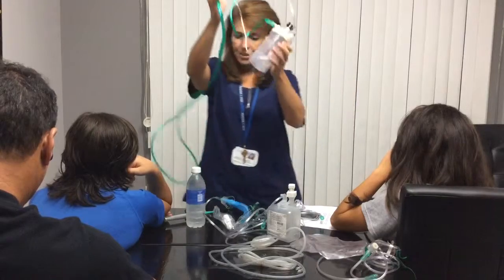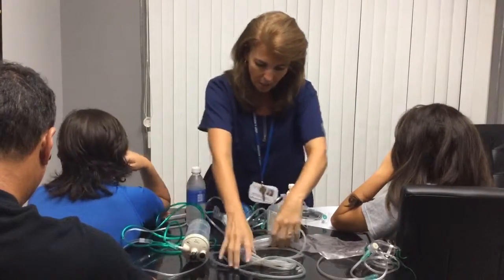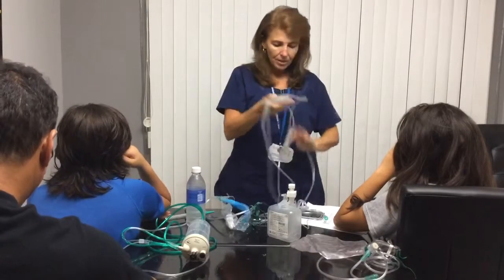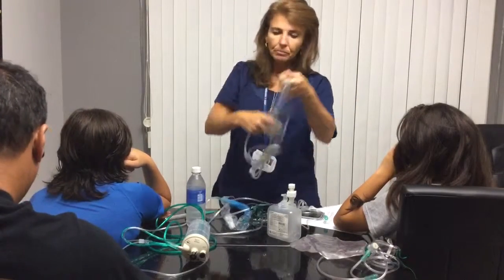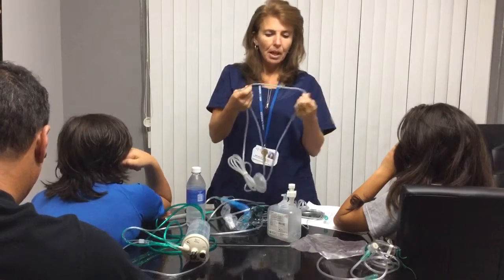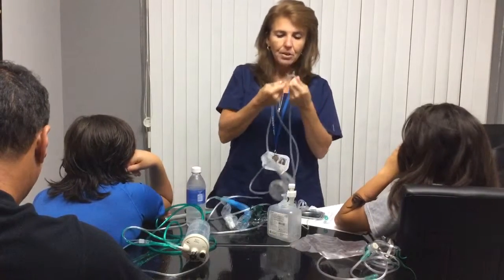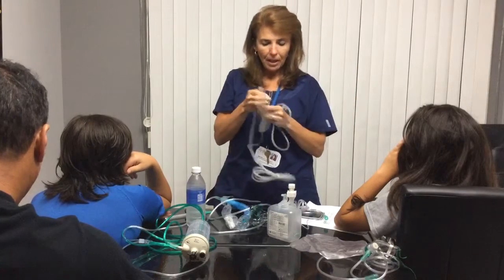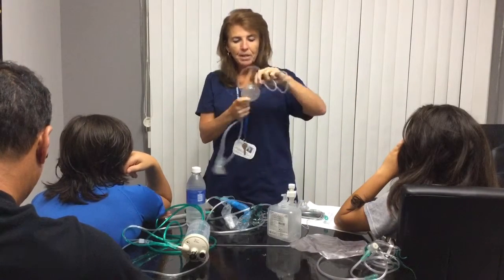Next type of high flow system is the oxymizer, and as you can see, this type of system has larger pillars for the nares, so sometimes it's not as easily tolerated. The tubing's pretty bulky, but it does have an oxygen pendant here.